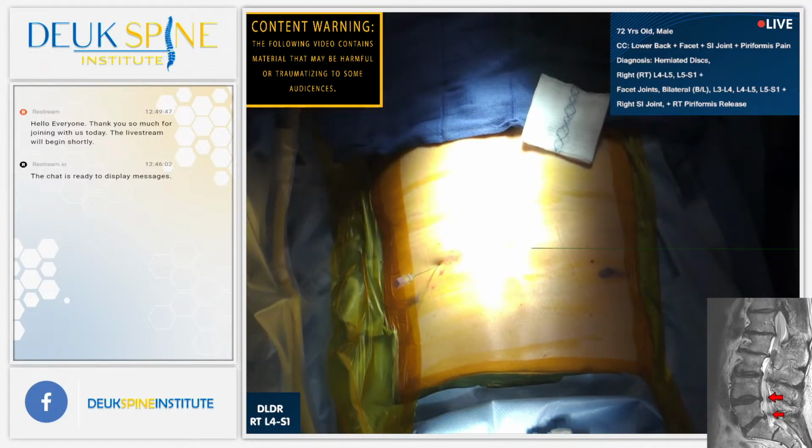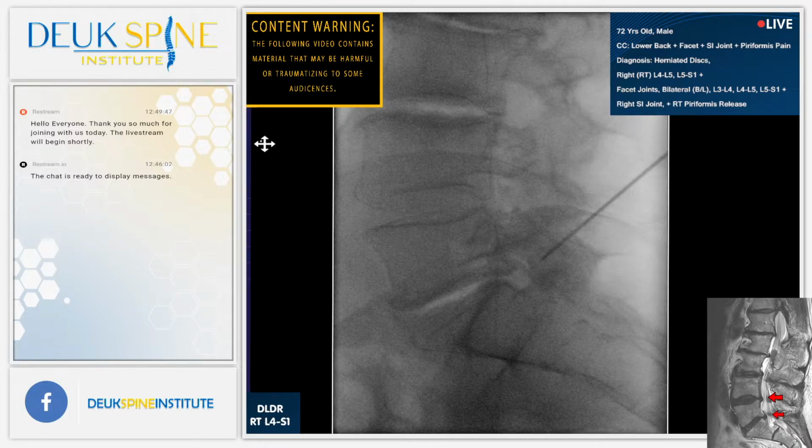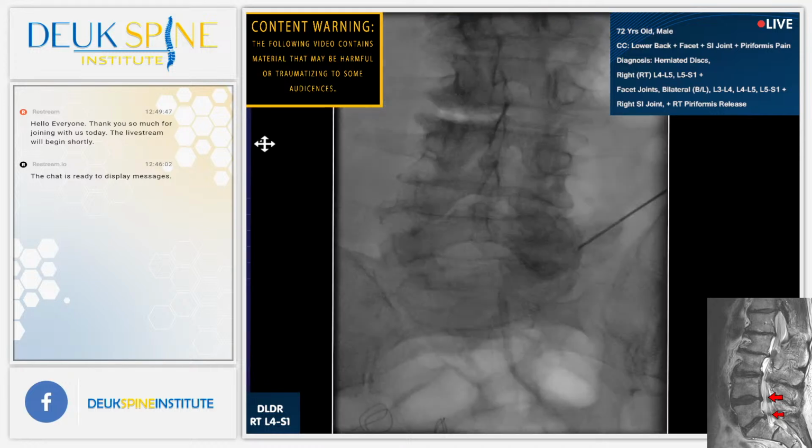Shot. That's our only hope, is coming more lateral. But I'm still hitting that same bone spur. AP. 5-1 may not be achievable. Let's see the MRI. Yep, still hitting the same exact spot.